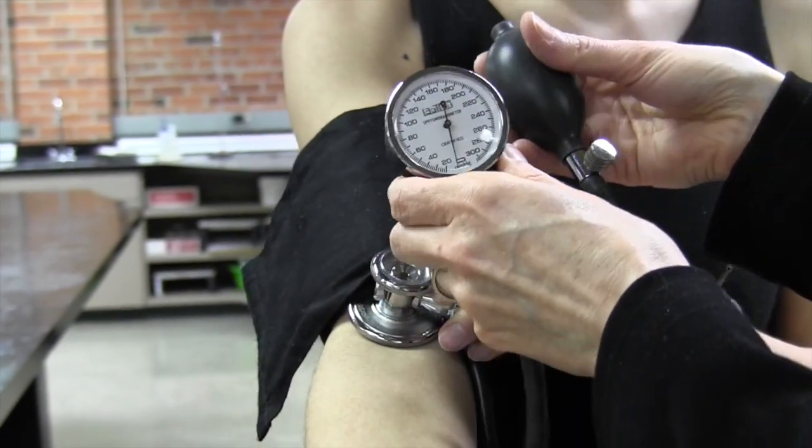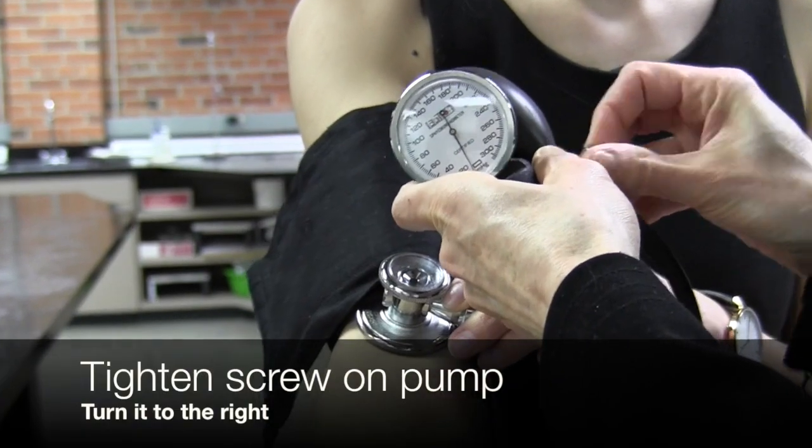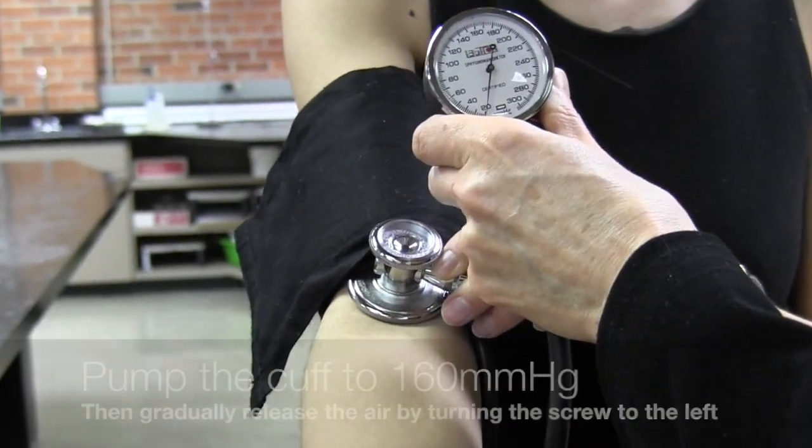Next we'll grab the dial and the pump, tighten up the screw on the pump, and then pump it up to 160.